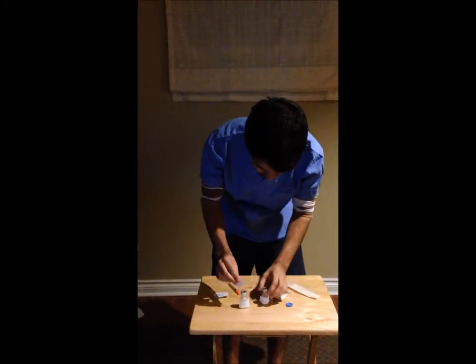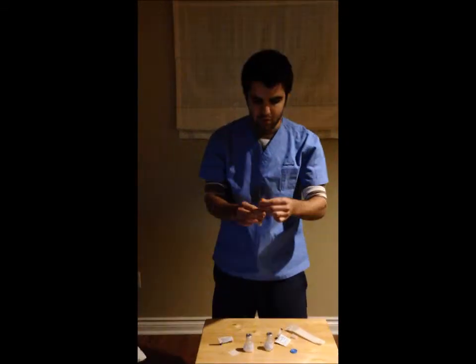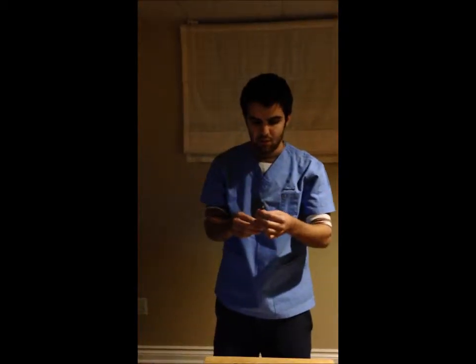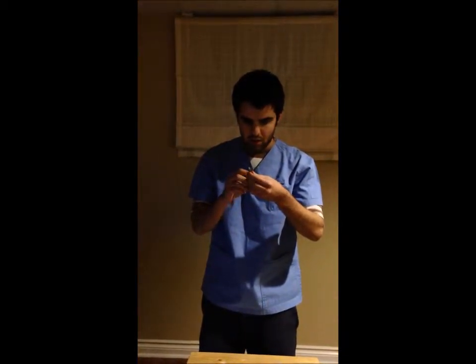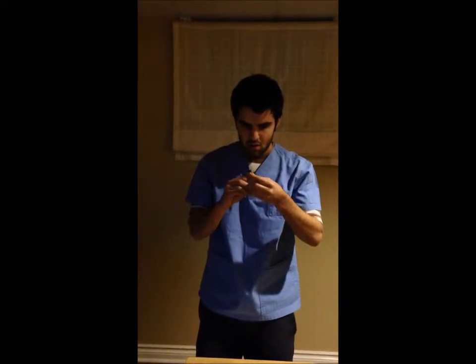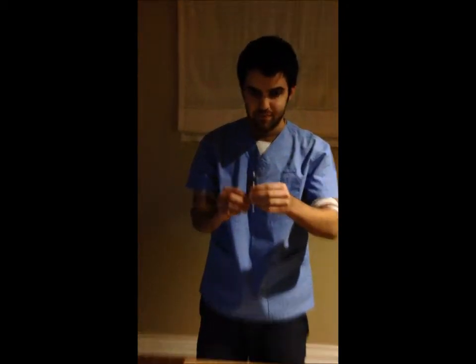So swab, and then swab, and then I'm going to decap my needle, and I'm going to put 16 units of air into the first container. So they're going up in increments of 2. So 16 units is going into the normal insulin.